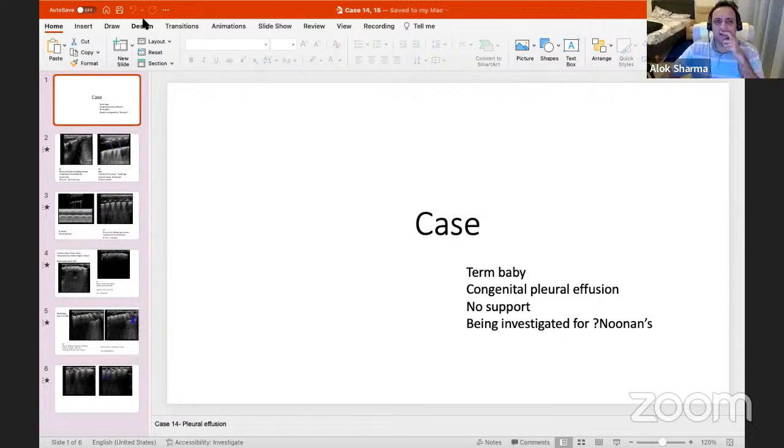It sounds like that's a sector probe, not a linear probe. No, because it's 9L written over the probe. Okay. So it's 9L, then technically it should go up to 9. But normally a linear probe, I wouldn't feel too worried about that. My gut feeling is that you'll still be able to get good images, as long as you're using 8 and 9, it works. Okay, thank you.